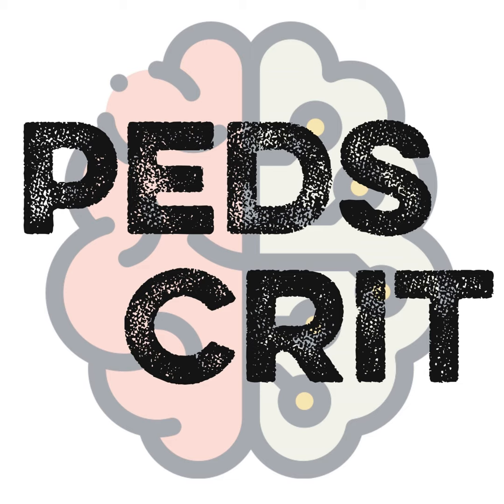Interesting. So you could add an inflow cannula to the IJ so that you're at least getting some oxygenated blood through and out that part of the aorta. If a patient has significant lung disease and their inflow is the FEM, that does sound very possible. Right? Yeah. And then that's their brain. Exactly. Yeah.